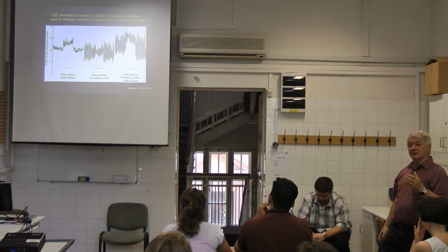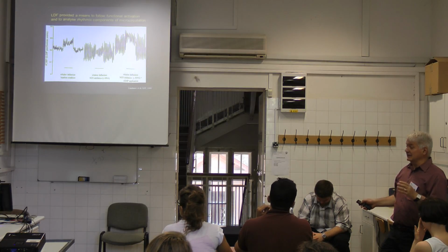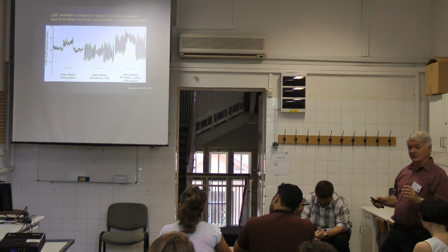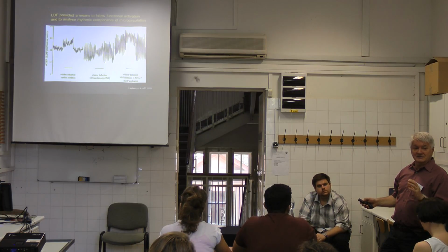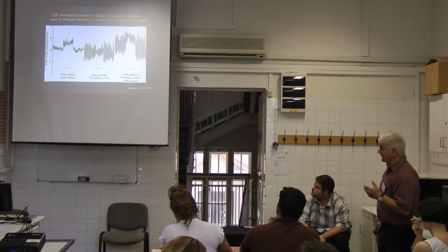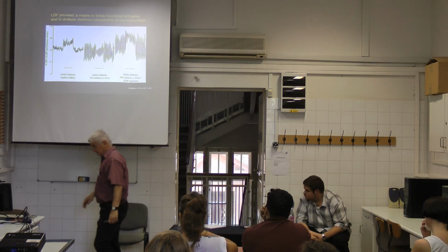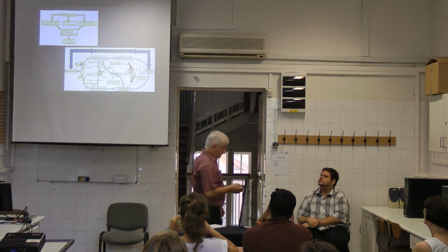So again, I'd like to highlight laser Doppler flowmetry combined with the stimulation and combined with a little bit of pharmacology showed something which was never discovered or observed before these methods. Why? Because the temporal resolution now enables us to see what is at the level of small microcirculation. So again, I'd like to explain.